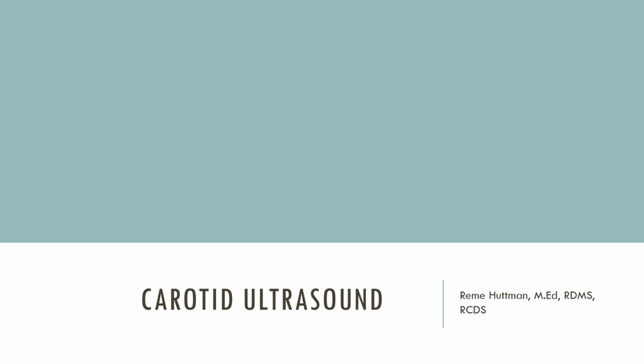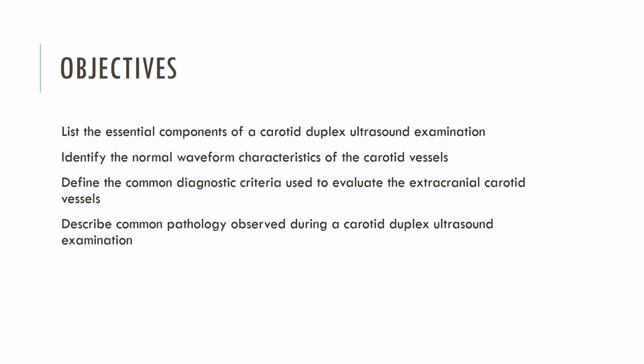We're going to talk about carotid ultrasound today and go over some of the details that may help you in your carotid scanning. Our objectives for today are to list the essential components of a carotid duplex exam, identify the normal waveform characteristics of the carotid vessels, including the CCA, ICA, and ECA, define the common diagnostic criteria used to evaluate the carotid vessels, and describe common pathology observed during a carotid duplex ultrasound exam.